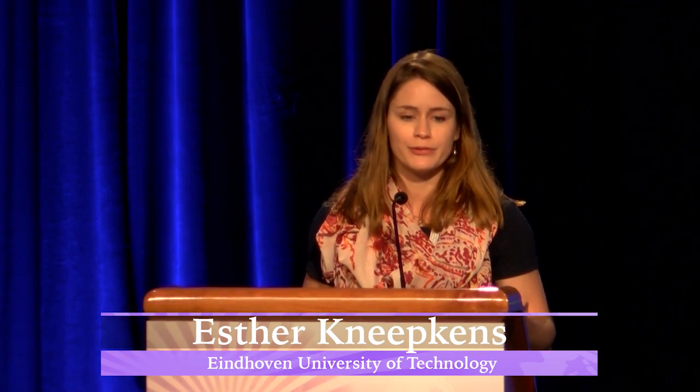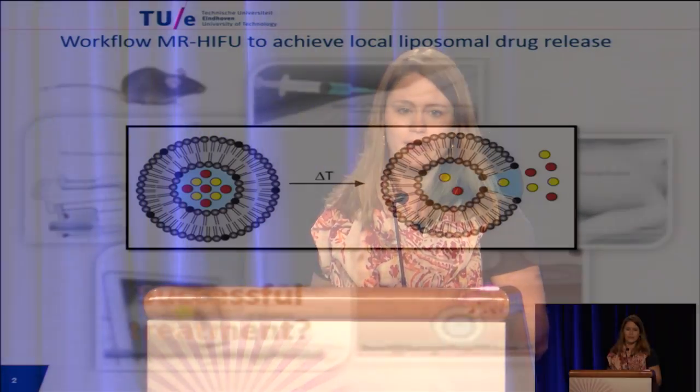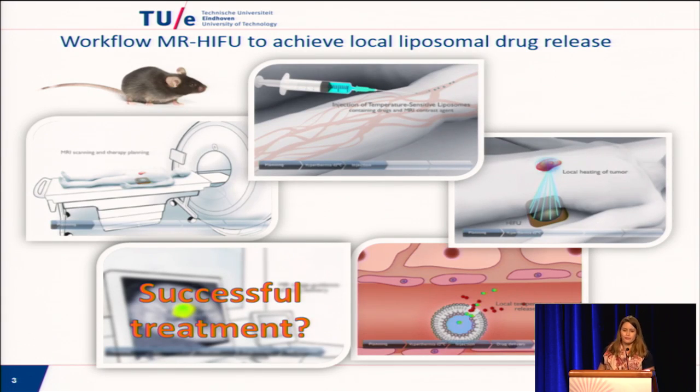So we also use temperature-sensitive liposomes, but the drug we use is doxorubicin. And another difference with the previous speaker's talk is that we put the gadolinium contrast agent inside of the liposome and not attached to the bilayer. So I'm sure you're all familiar with the workflow of MR-HIFU.